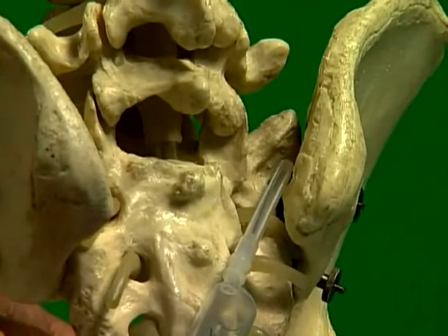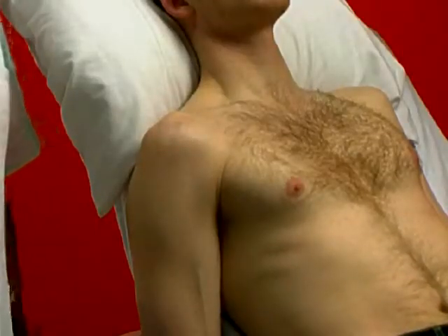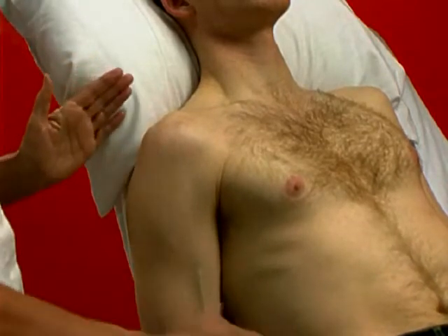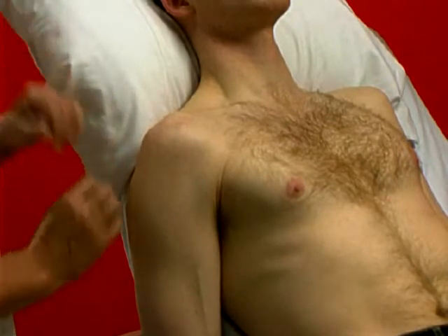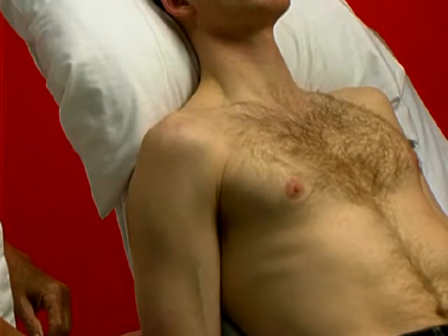The patient is examined, diagnosis made and informed consent obtained. He is placed in a half-lying position, comfortably supported, with the arm hanging over the side of the plinth. First prepare the equipment.